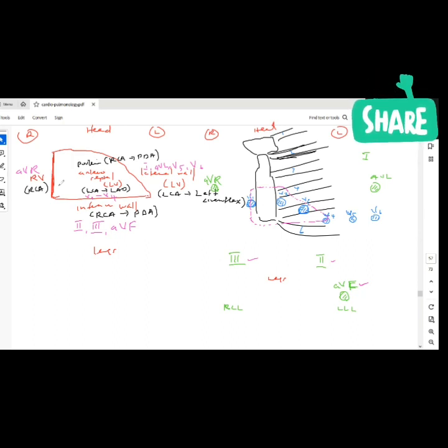Right ventricular is also right coronary artery; aVR looks at it directly, but I'm going to show you something else we can do to look at the right ventricle soon. Then lateral wall: I, aVL, V5, V6, left coronary artery, the left circumflex supplies that. Inferior wall: RCA, PDA, specifically leads II, III, aVF.